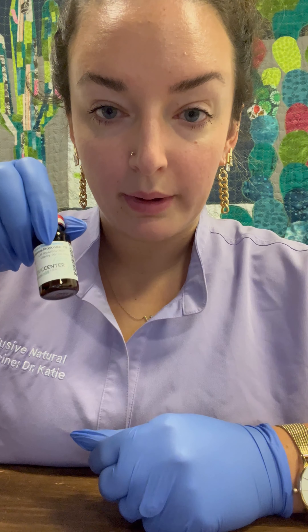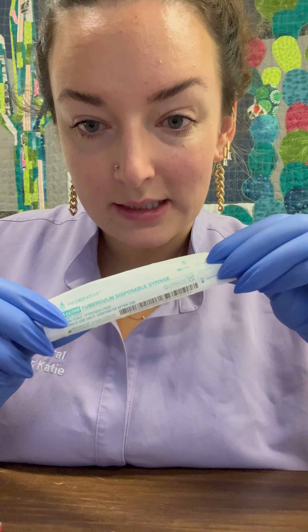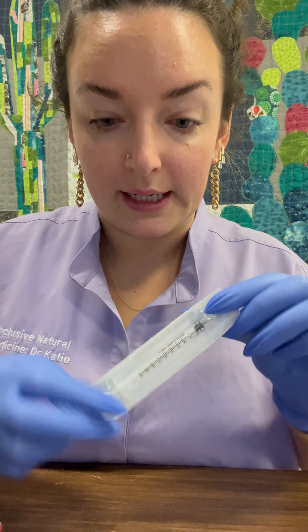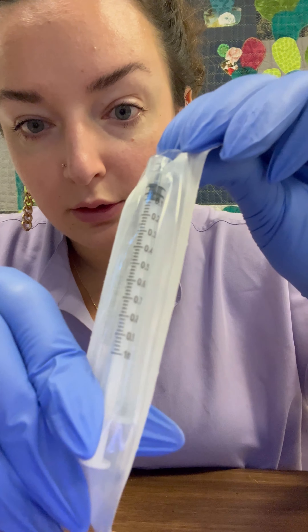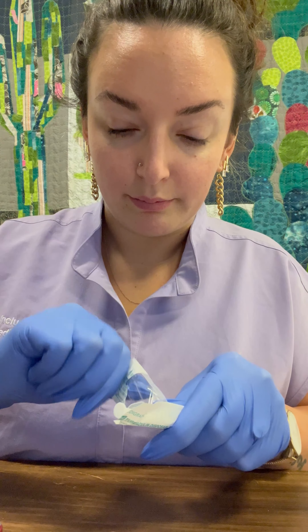Hello, I'm going to show you how to draw up your testosterone. First thing is you can remove the vial from the bag and from the bubble wrap if it came in that. You should have received 1cc syringes. They may not look like this exact brand but they'll have little delineated lines like this. First thing you'll do is simply pop it open and pull out the syringe.